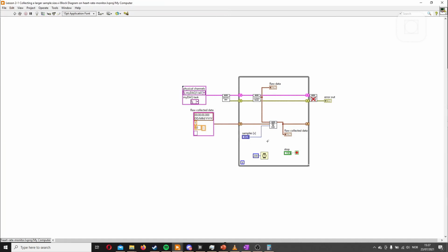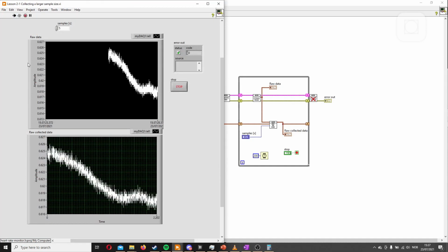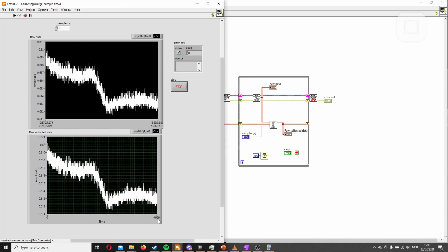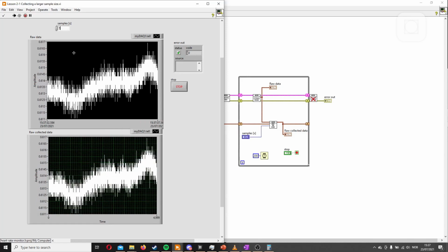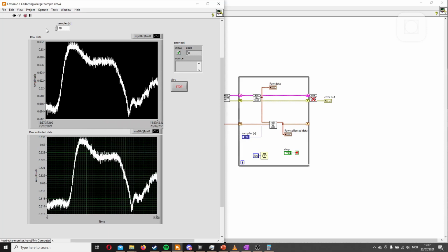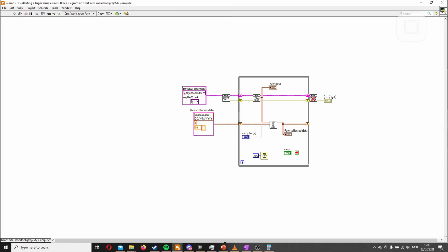And let's test that it works. And we see it stops at 5 or just shy of 5 seconds here. And it goes to 5 seconds here. And we'll select it 5. We can change it to 10. We see that everything works as normal. We can just now control the size, which will be good for filtering. I'll just save it. That's it for this lesson of collecting a larger sample size.